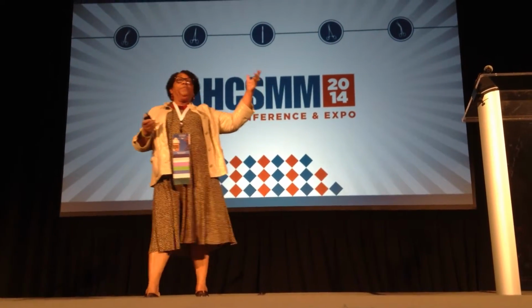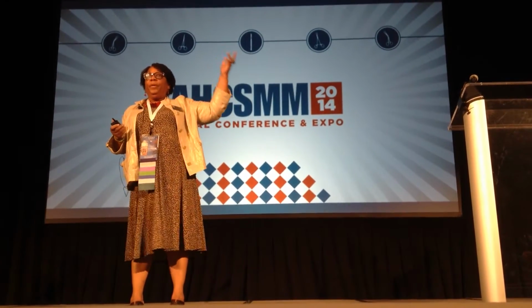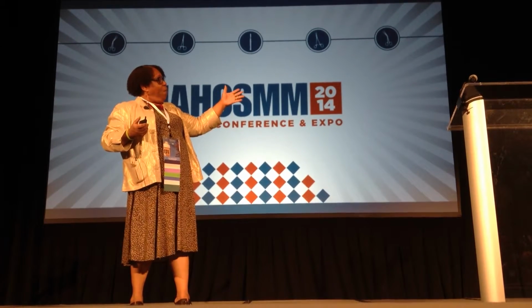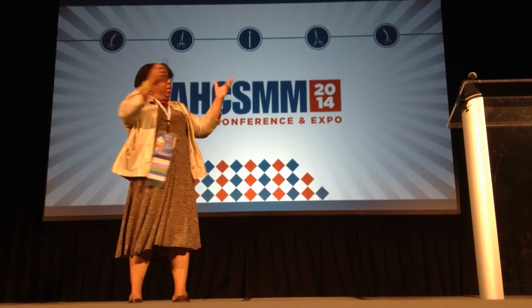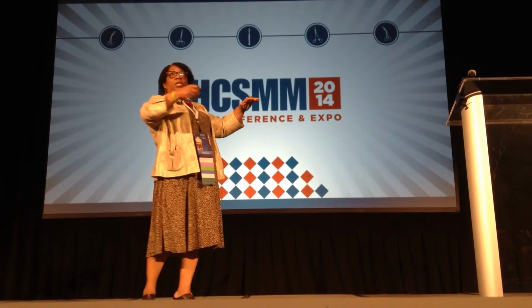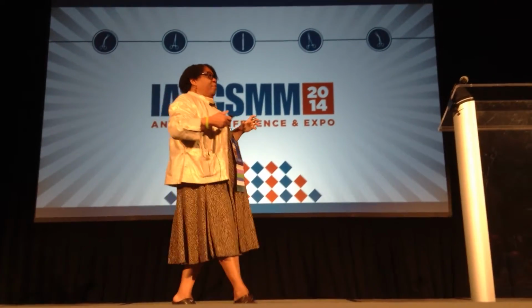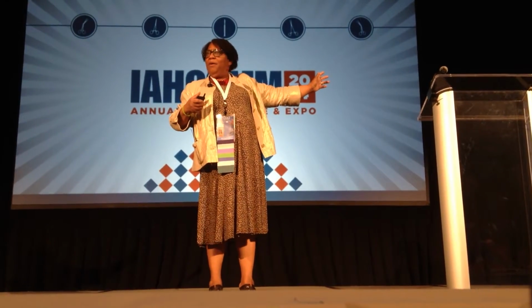I'm in a 100-year-old hospital, so we have a dumbwaiter system. I would love for the dumbwaiter door to open up, the cart roll off, roll around the corner, stop in front of the washer decontaminator, little beep, beep, beep, and the trays hop up and get on the right levels. Make sure that the lock boxes are open. Make sure gross bioburden has been removed, and then go on about his business. Yes, I wouldn't need an FTE in that spot. But the reality is that's not going to happen.